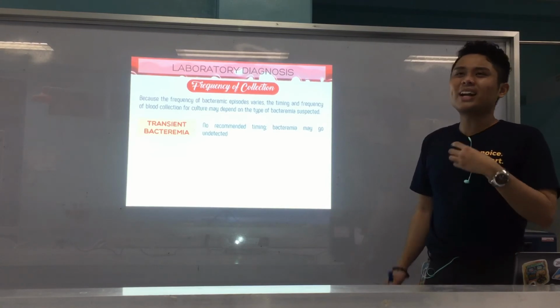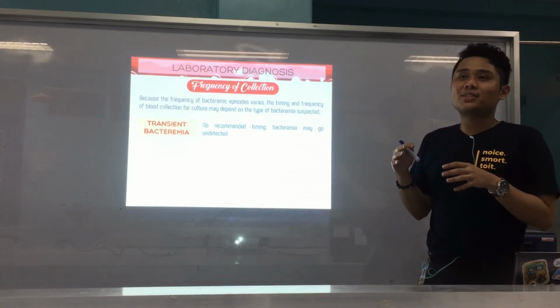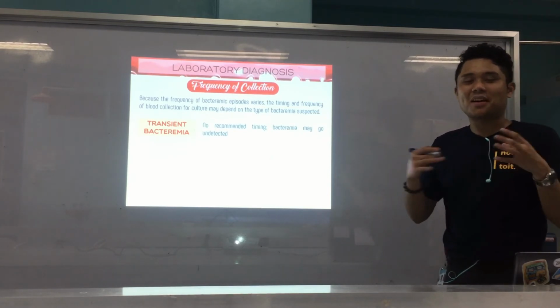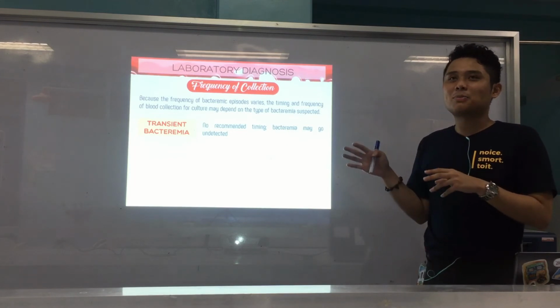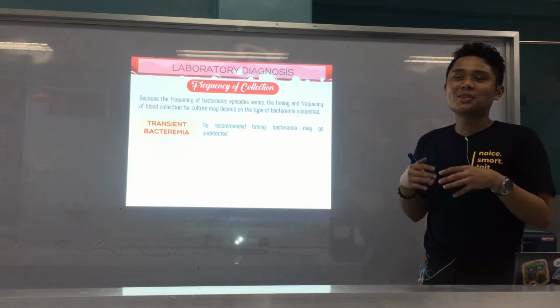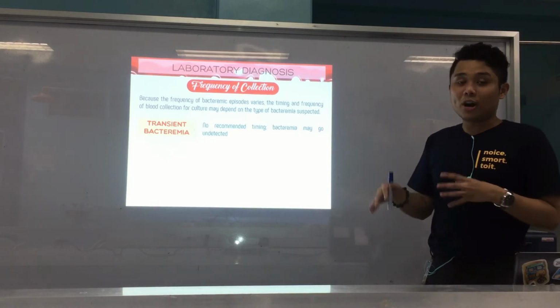So, wala ray recommended timing because again, chances na dili ra ma-detect ang bacteremia or dili makuha ang pathogen kay transient raman. Okay, so mura siya in a way, ako pagsabot niya, try your luck, okay? Or like, kanang trial and error. But anyway, because that's transient, okay? So, no recommended timing lang.